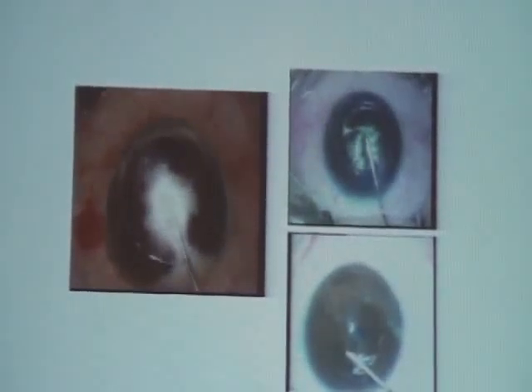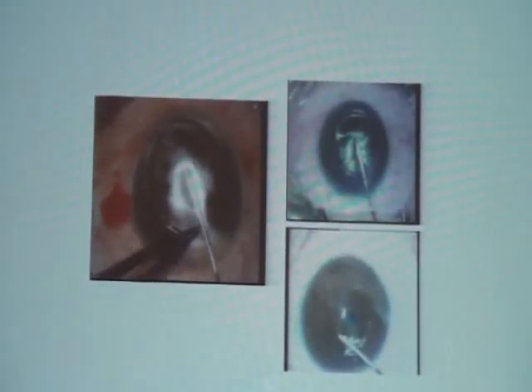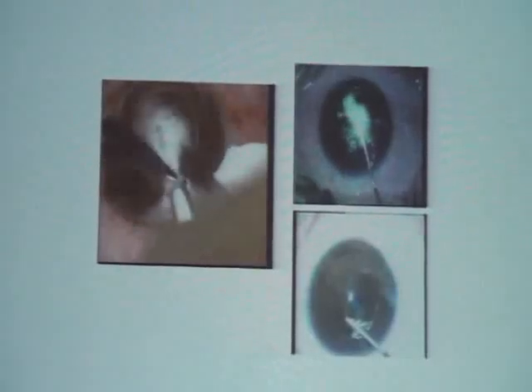That's to show the different kind of bubbles that form. You can have a bubble which has a very kind of glossy appearance instead of the dense white border. And sometimes you can get a mixture of both. You can get the type 2 bubble, or you can get a combination of both.